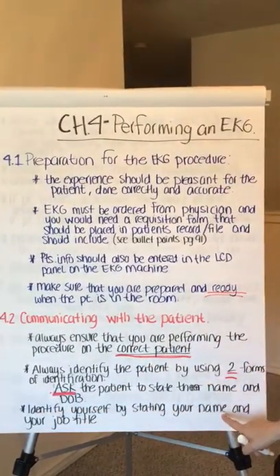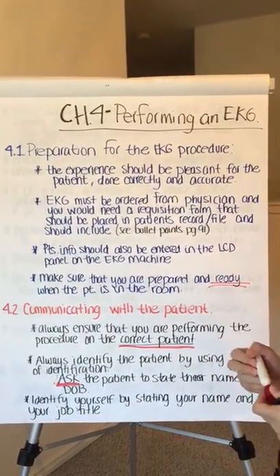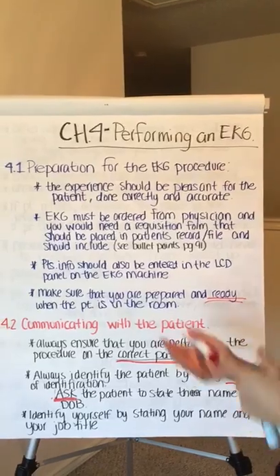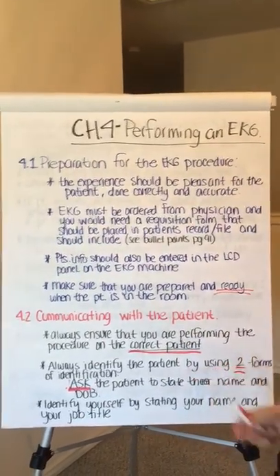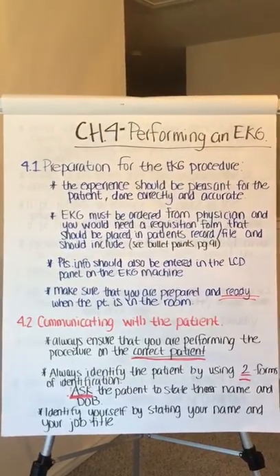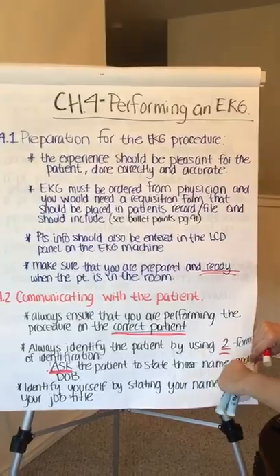Identify yourself by stating your name and your job title. So when you go in, you always say, hello, my name is Anita Toral. I am an electrocardiogram technician. Can you please tell me your name and date of birth? Okay? I hope so far nobody's having any questions.